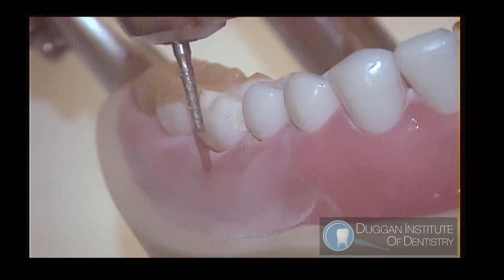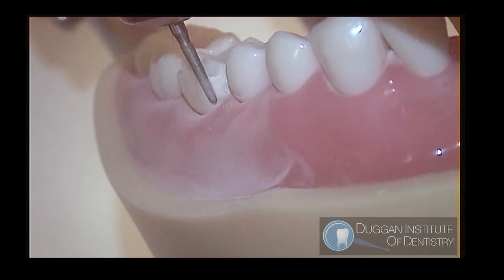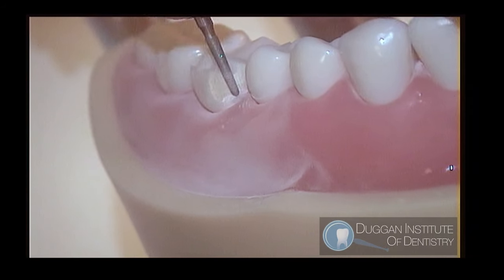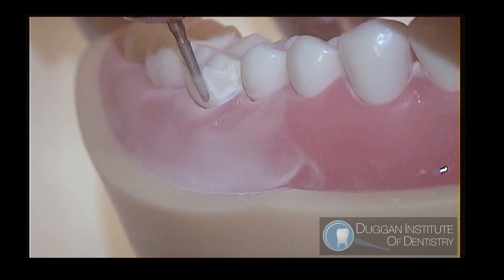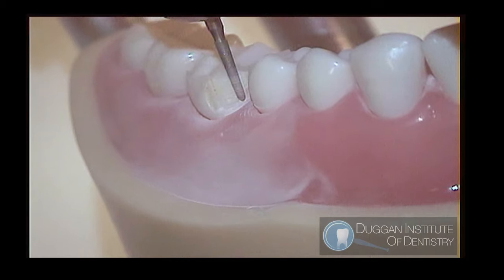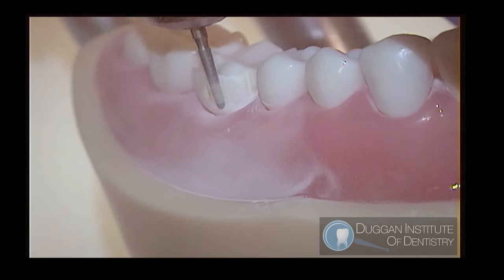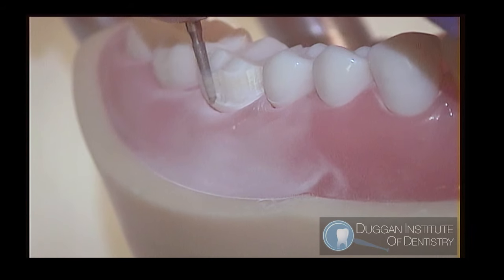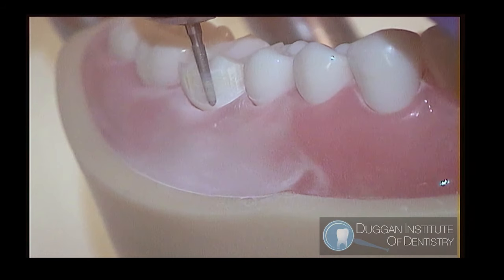The facial axial reduction. In order to reduce the axial surface, we look along the wall. This allows us to see the taper, the tip of the burr, and along the wall. The burr I'm using is a medium-sized chamfer 878K 0.014 diamond. Axial reduction is 1 mm to 1.2 mm with a 1/2 mm chamfer. Keep the gingival margin a little more than 1/2 mm above the gingiva.